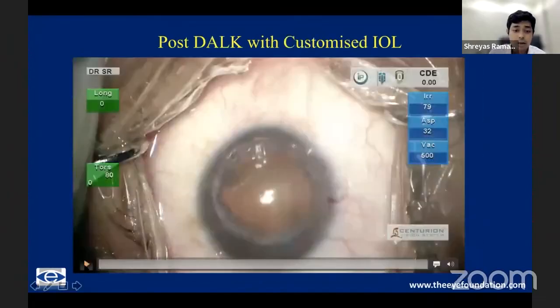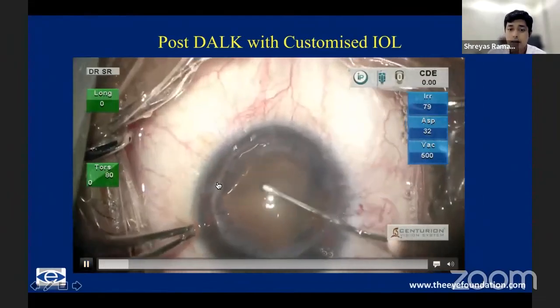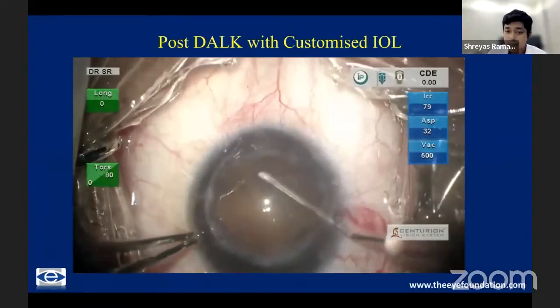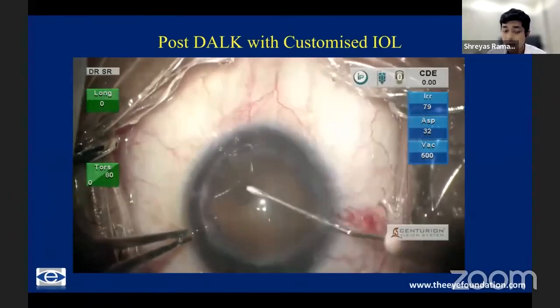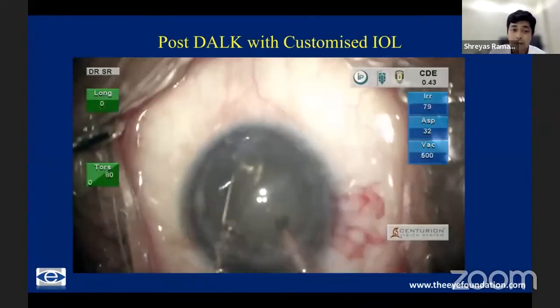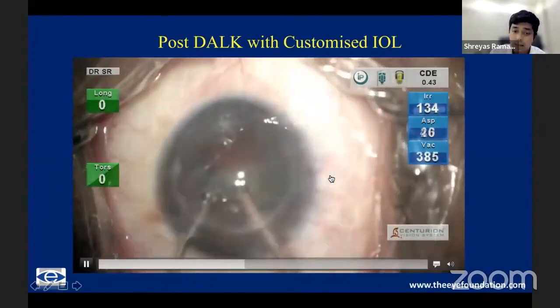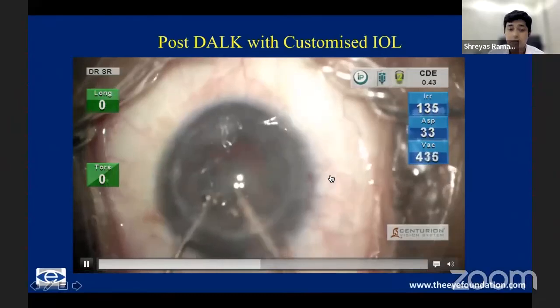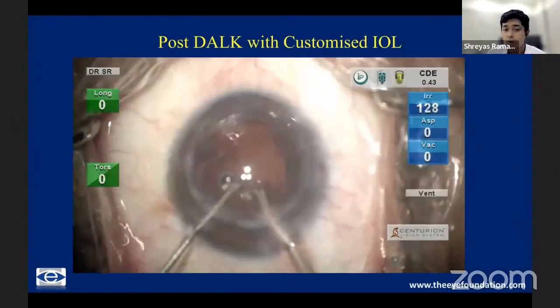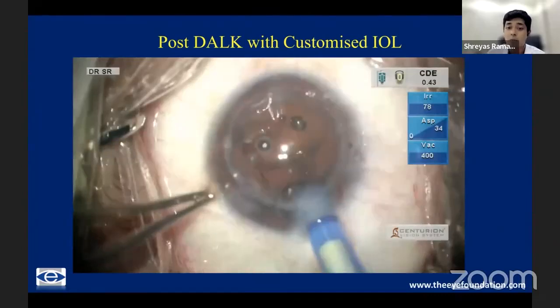This is another scenario where a patient post-DALK had also developed a steroid-induced cataract. And as we know, in DALK, the chance of rejection is very less. The long-term survival is very, very good. And these are patients where even higher degrees of astigmatism can be corrected very, very comfortably. So this was a DALK for a post-keratoconic patient and had a significant residual astigmatism, almost 9 diopters of astigmatism. And if you implanted a monofocal IOL, even wearing glasses for such a high cylinder would almost be impossible.